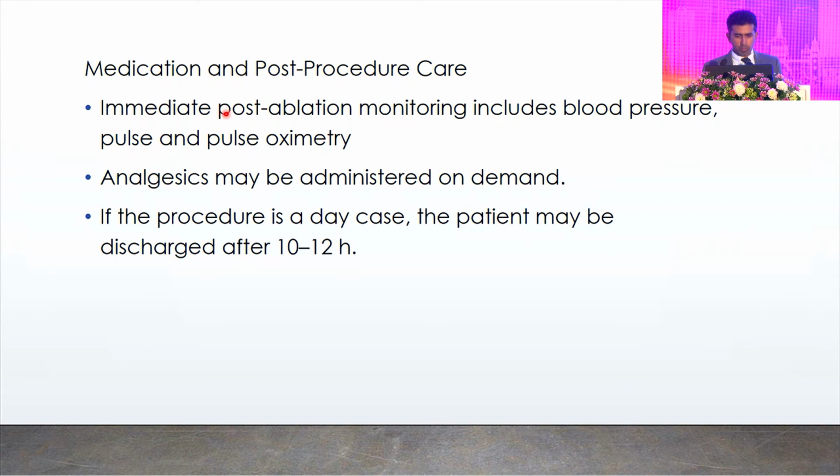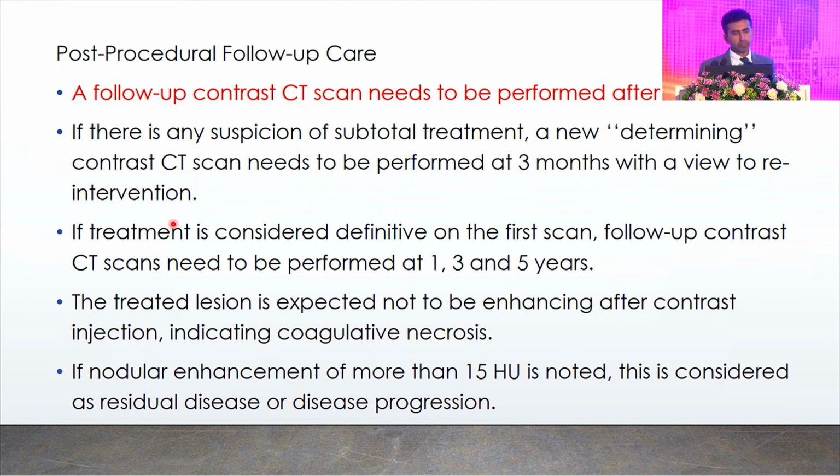Medication and post-procedure care: the immediate post-ablation monitoring is vital. Analgesics can be administered, and the patient can be discharged on the same day if there are no complications. A follow-up contrast CT scan is needed. The routine practice is between 4 to 6 weeks. Always we can go for a second ablation if there is any residual.